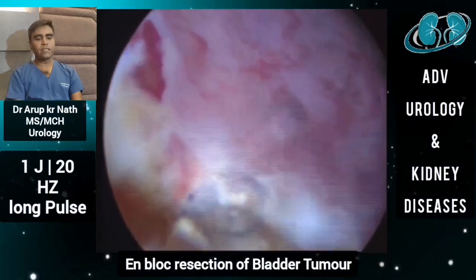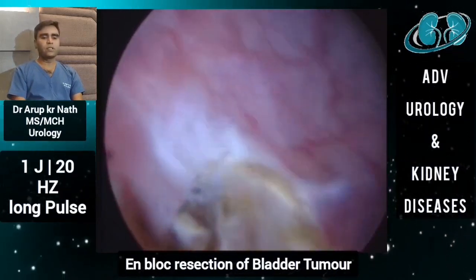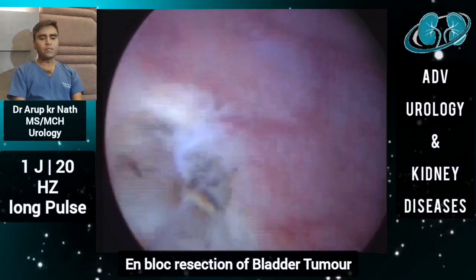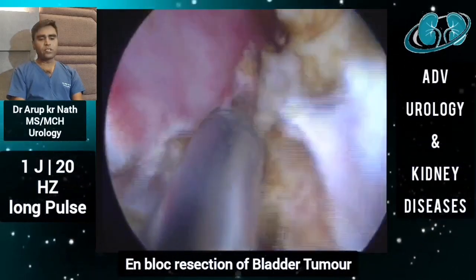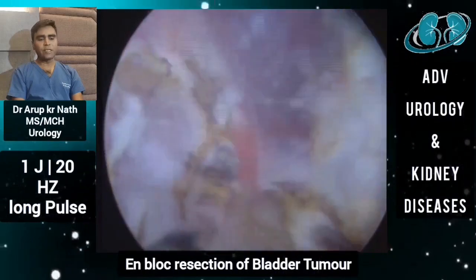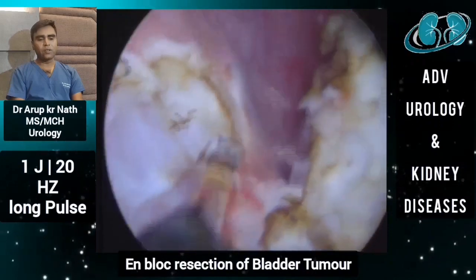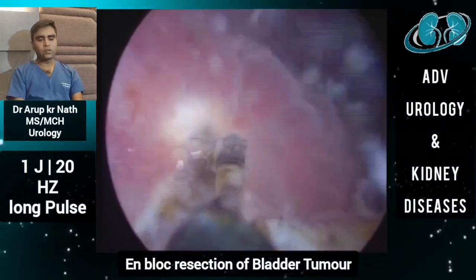For tumors less than 3 cm, the specimen most of the time comes out with the ELLIK evacuator, or sometimes we may need to cut the tumor into two or three pieces using the same laser fiber. But if the tumor is more than 3 cm, or this large, we usually use a morcellator to take out the tissue.